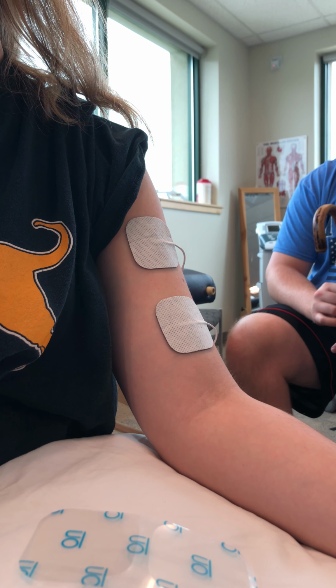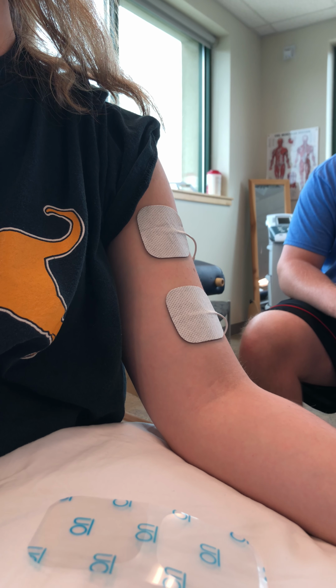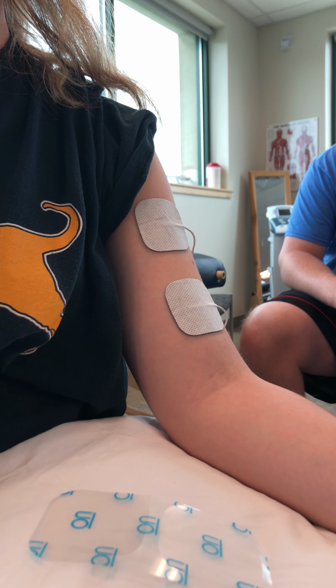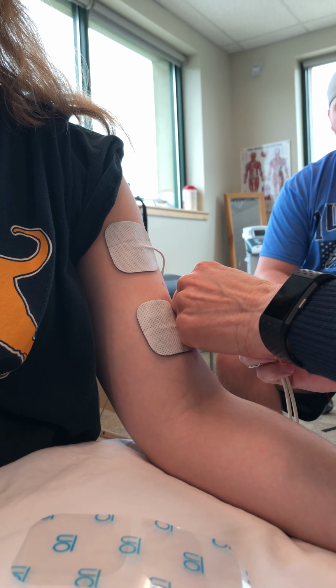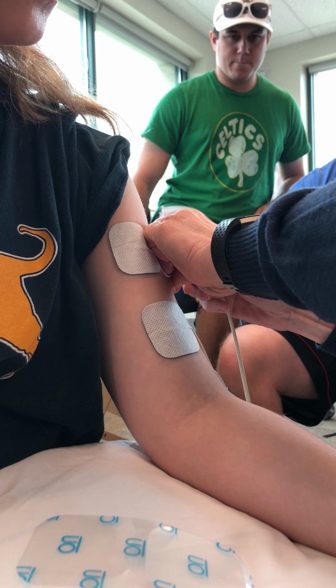And again, I know it's one channel because only one channel is lit up. And I just want one of these, doesn't matter what color it is, just so they're both the same length. And again, no wires showing, right?